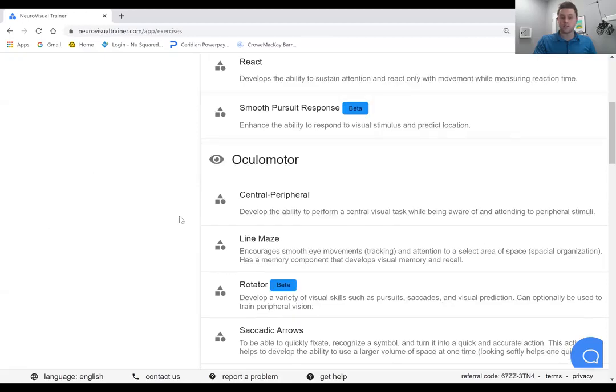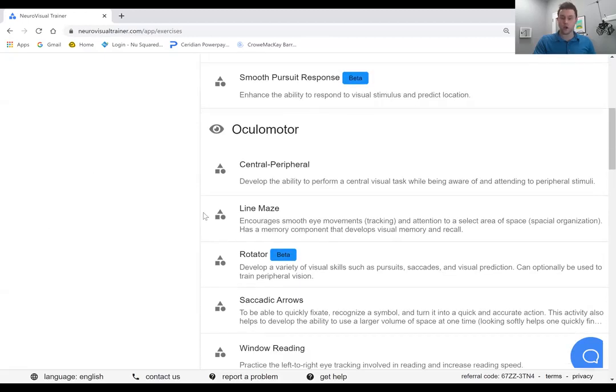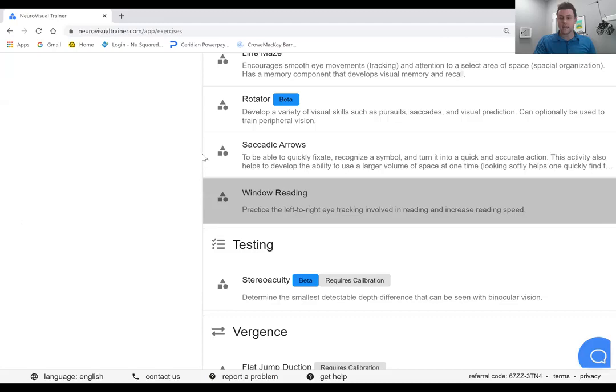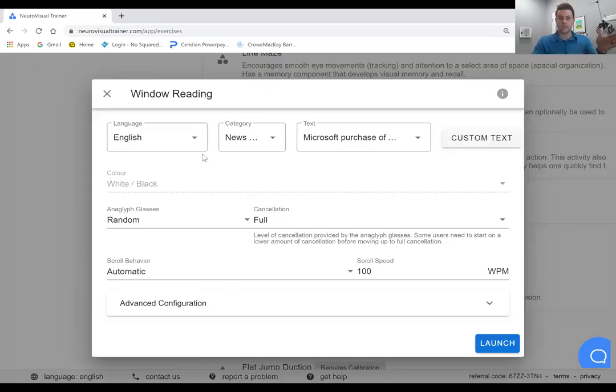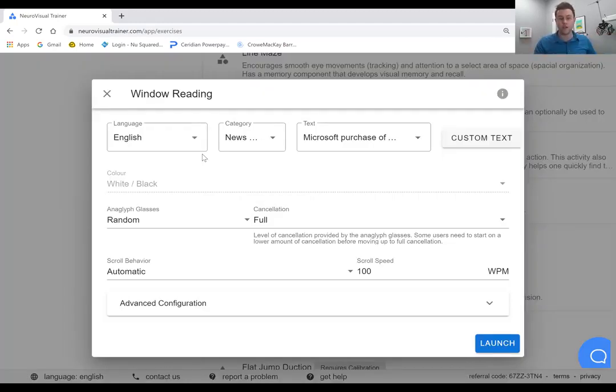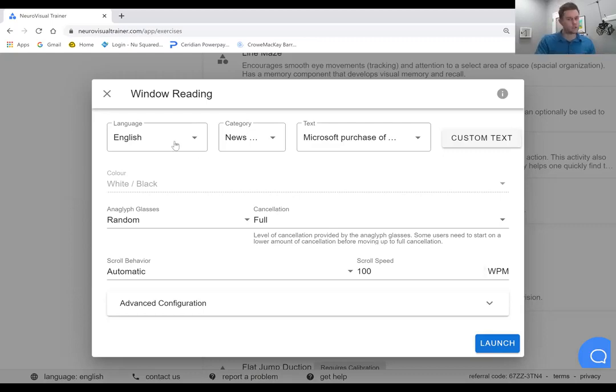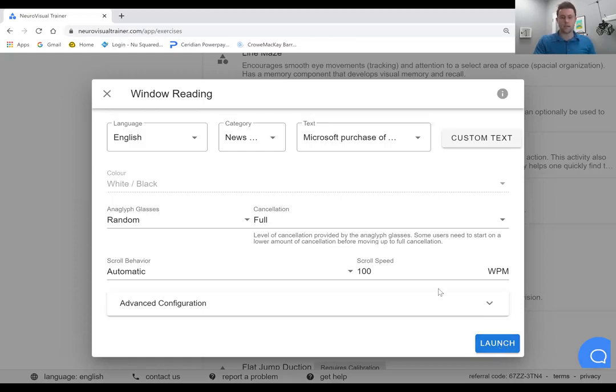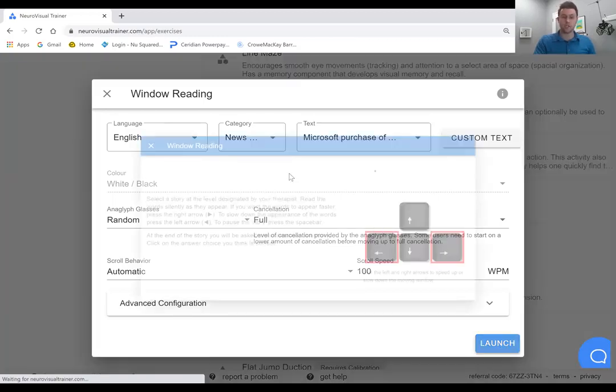I mentioned there that you can do it with binocular reading, we also have window reading, which is the block of text is going to move at a predetermined words per minute. You can still choose English, you can choose news. We're going to choose a story about Microsoft, a hundred words per minute, we're going to launch it.